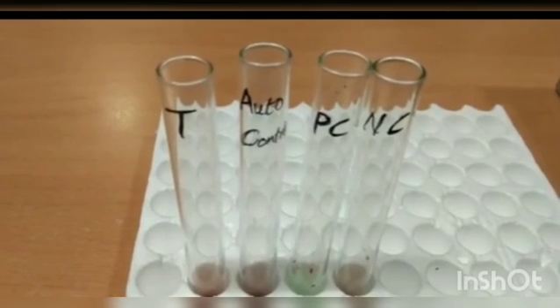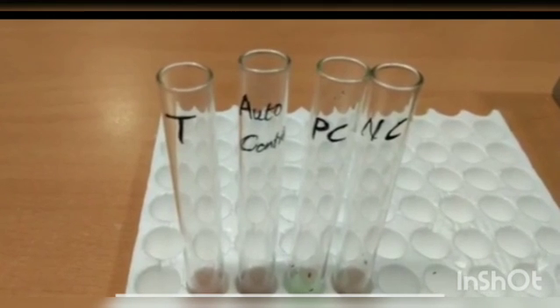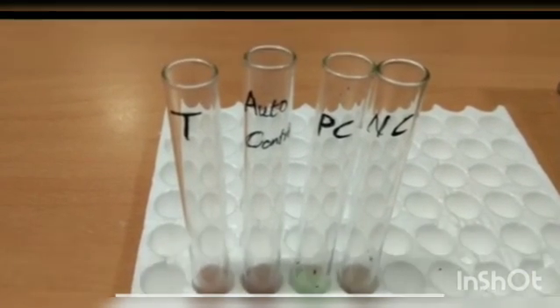In this test, the test is negative. There's no agglutination, so it shows that no autoantibodies are seen. So I hope you have understood.